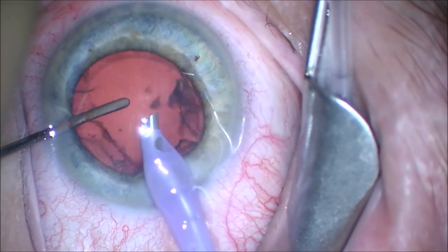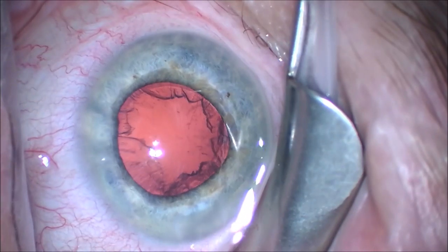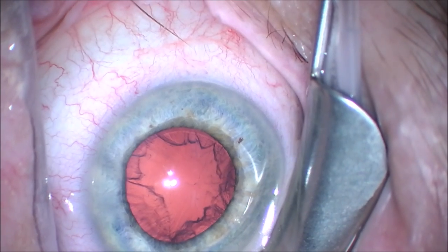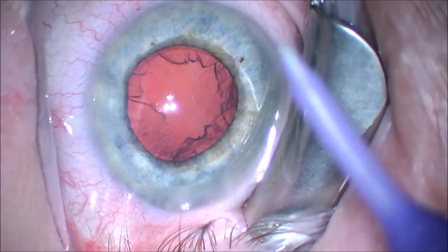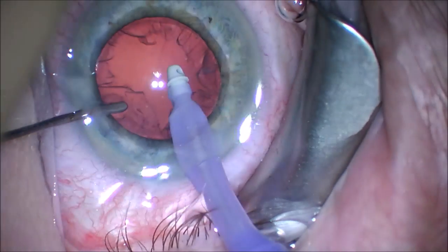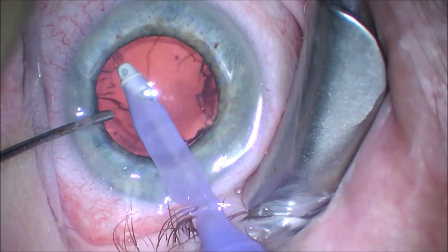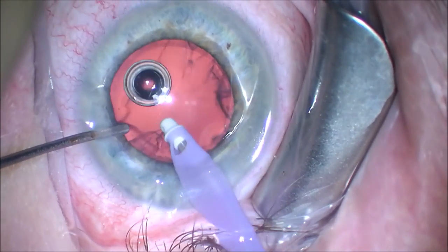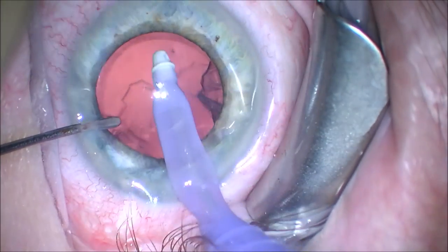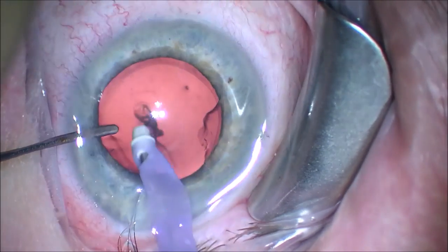After removal of the nucleus of the cataract, we're left with the cortex, which is the surrounding layer. We'll remove this with a new irrigation aspiration tip I've been trying lately called a polymer tip — this one made by Alcon. I use it sometimes instead of a silicone or steel tip, and it's fairly easy to remove the cortical remnants, as you can see here, and it's easy to get the sub-incisional cortex. These are disposable, and in my hands seem to work as well as the silicone tip or steel tip.